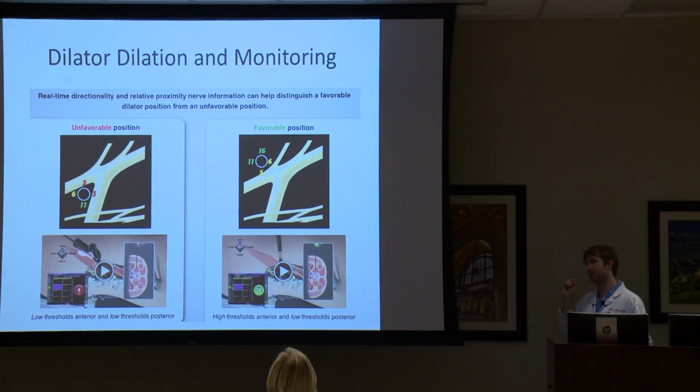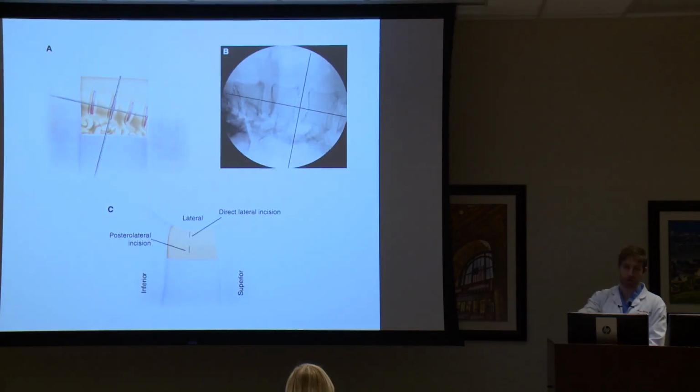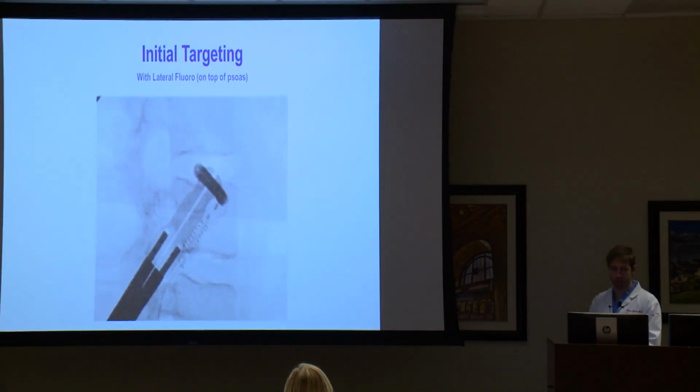So what happens is you put down a little monitor, if you will, right into that disc space, kind of right in there where that X is, and you lock it in and you get an x-ray. So you put it in like this, and this is what your x-ray should look like. And so you've got this little dilator, and this dilator is in the disc space, and it's telling you whether there's a nerve or nerves, because there are a bunch of big bad nerves that live on top of the psoas or around it.